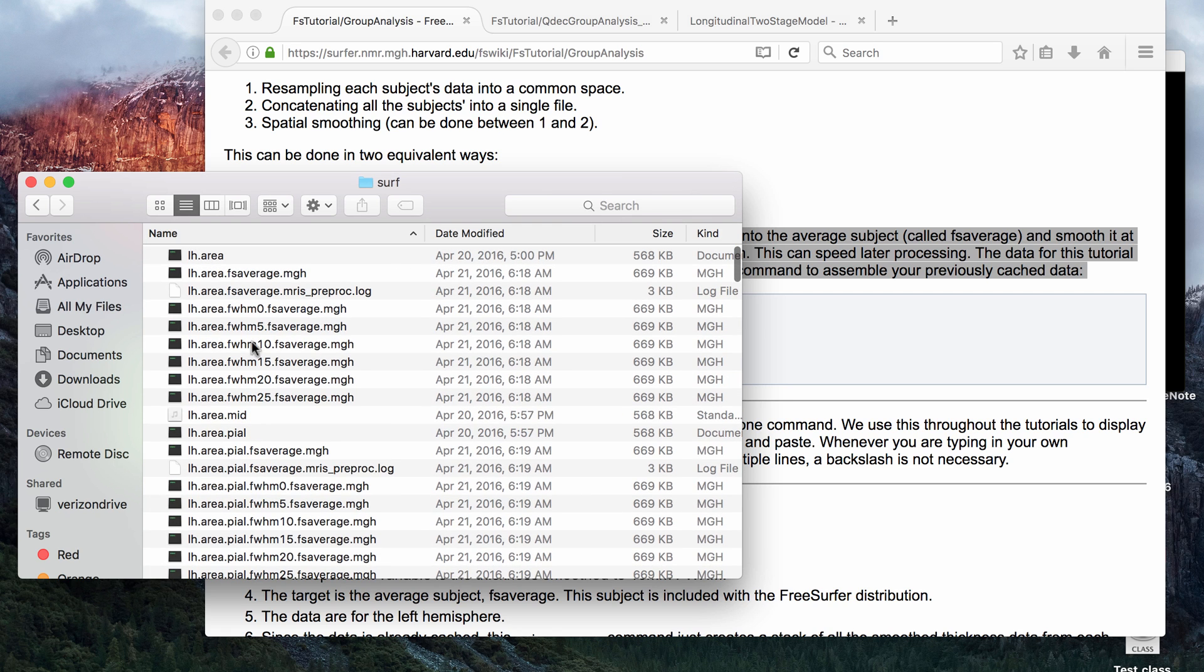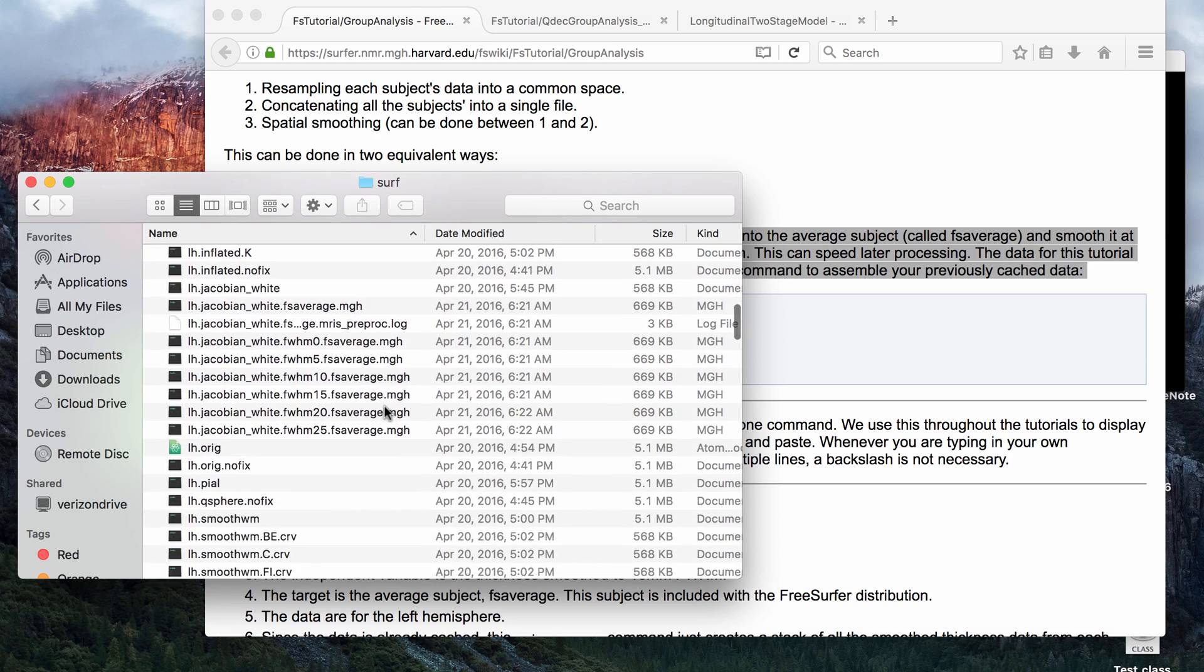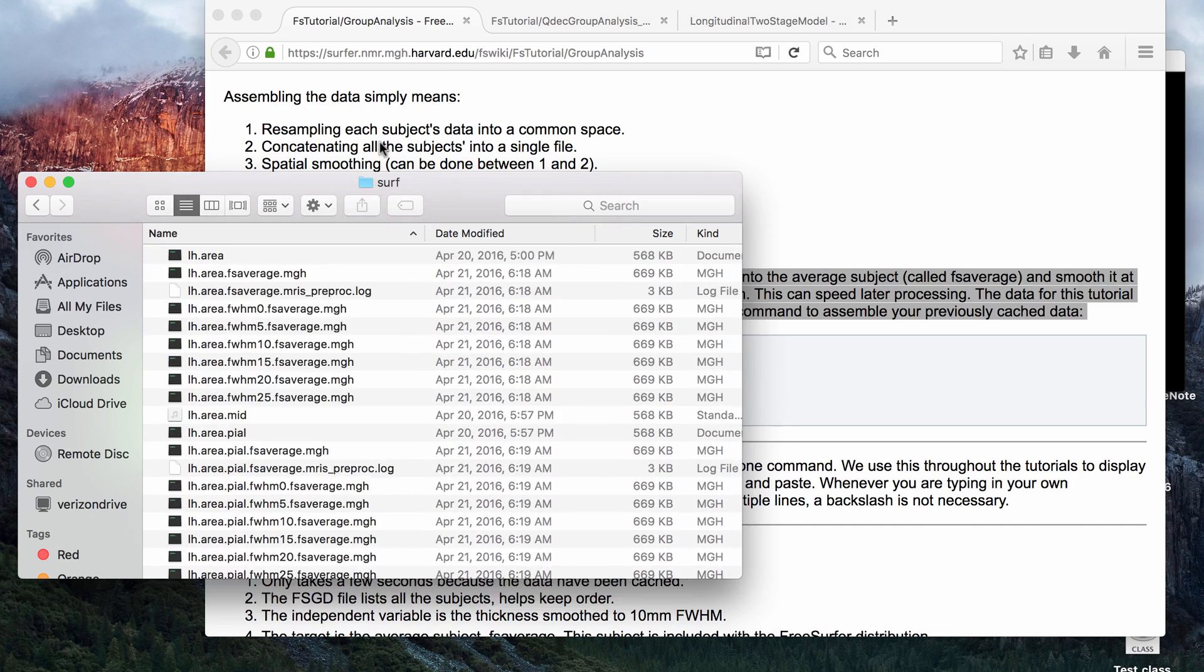now there are files that say full width half maximum, and then the millimeter of smoothing, and they also have FSAverage. These are the extra files that are created from the Qcache command.